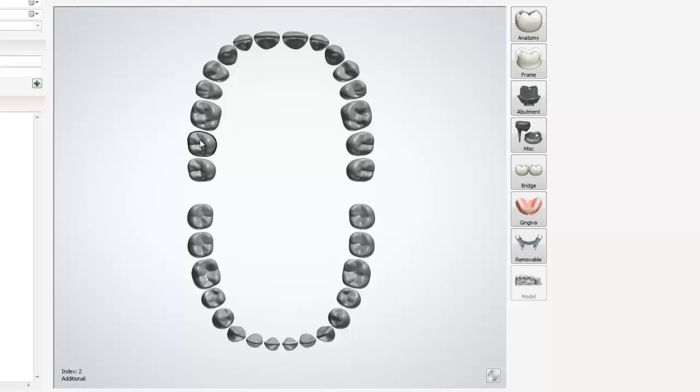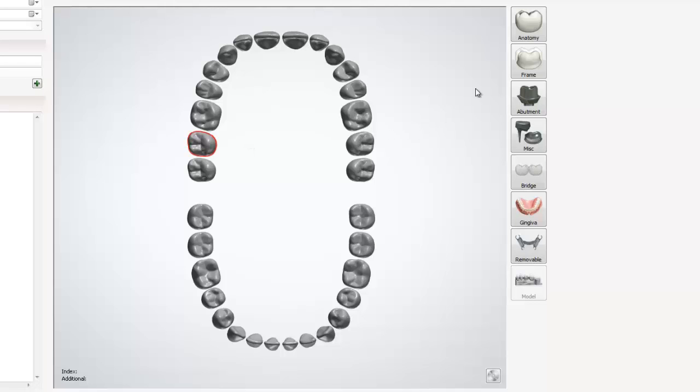Now let's go ahead and select the tooth that we will be working with. We can do this by left mouse clicking on the picture of the tooth. In order to deselect the tooth, you simply left mouse click in the white space that's next to the tooth.